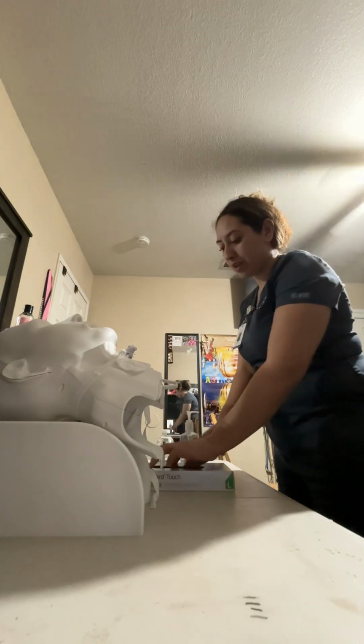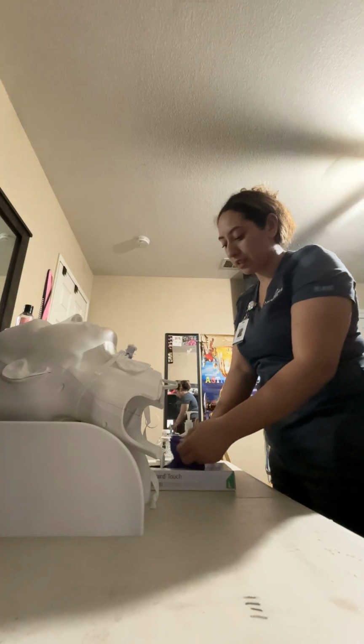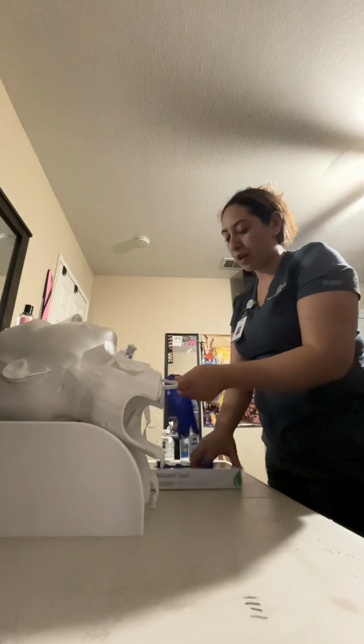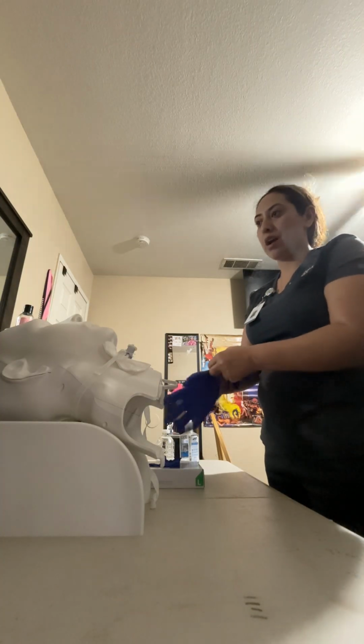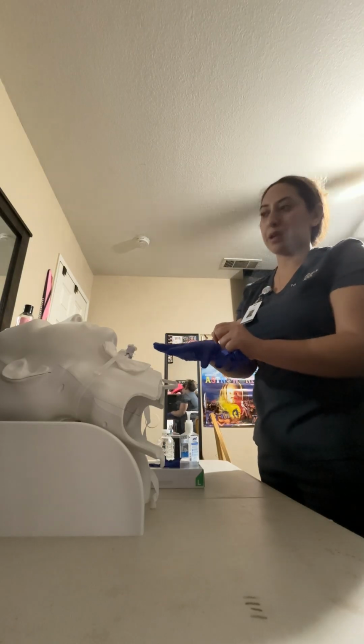So during this time, I will have already checked my patient's blood pressure and vital signs. I'm going to place a pulse oximeter on the patient's finger to monitor his saturation throughout the procedure. I'm going to go ahead and pre-oxygenate the patient for about 30 seconds to make sure that they have good oxygen airflow before we get started.